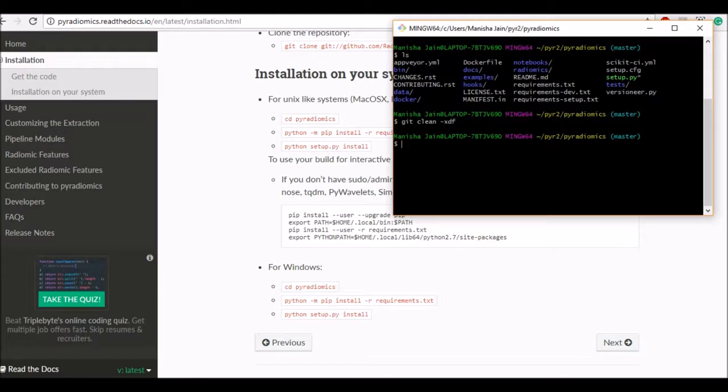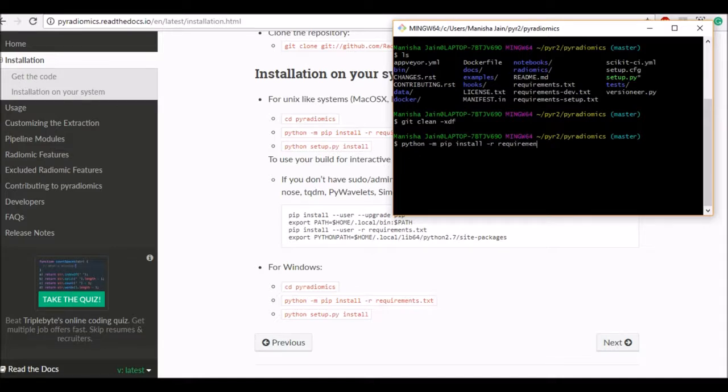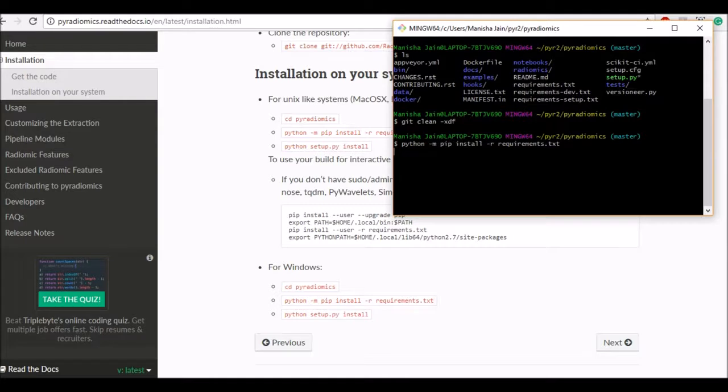So first command I will follow is the python dash m, this is the python module invoking pip to install everything under file requirements.txt. So this will take some time so I'm going to pause the video and we'll come back once this is done.